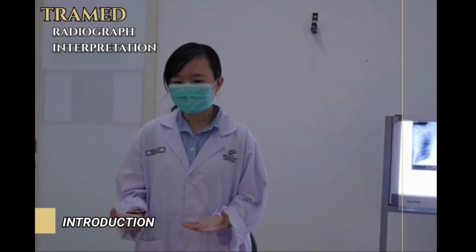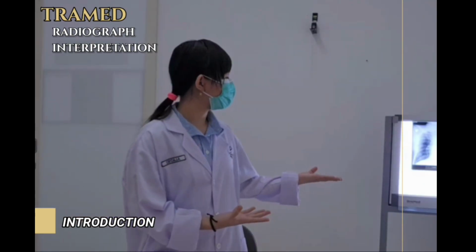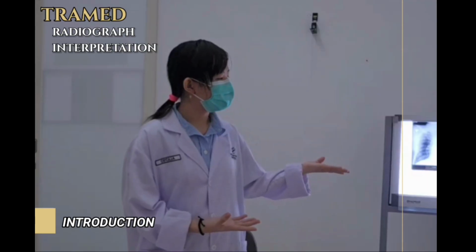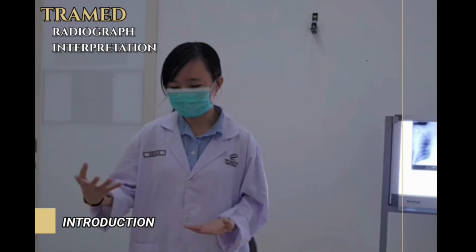After that, our greeting and also the introduction to the patient. So good morning, Miss. For the first, let me introduce myself. My name is Dr. Cecilia. And for today, I will be the one who is checking your radiograph interpretation skills. Is there any abnormality in your heart, or maybe is there any fracture or not? So we must check about the radiograph interpretation skills.